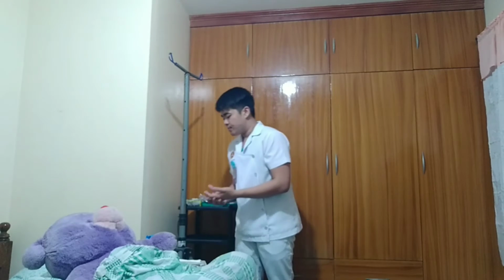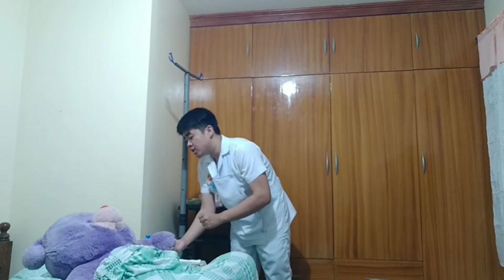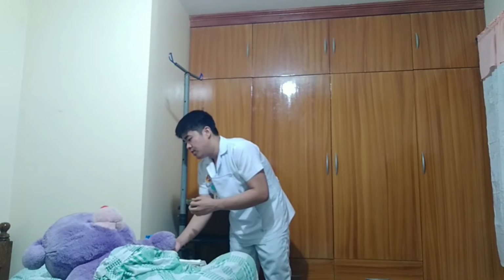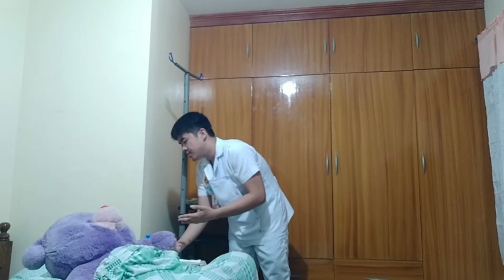And then we're now going to ask the client to clench and unclench his fist, and we're going to tap the veins. Sir, can you please clench and unclench your fist? Thank you, sir.